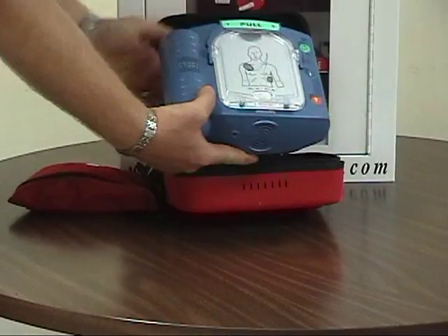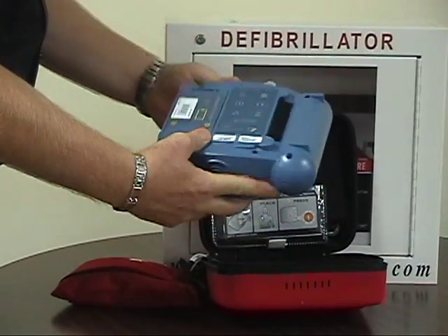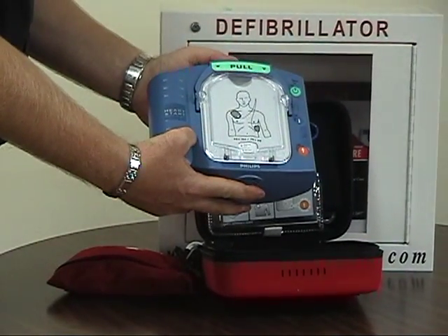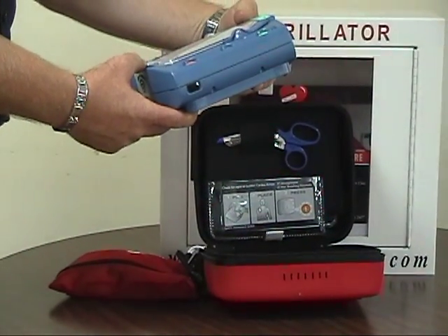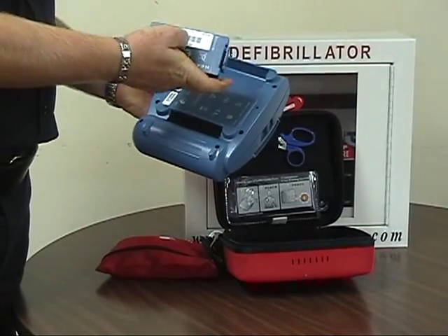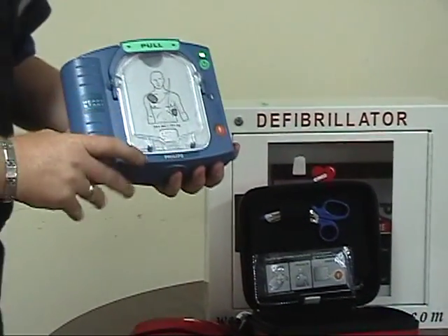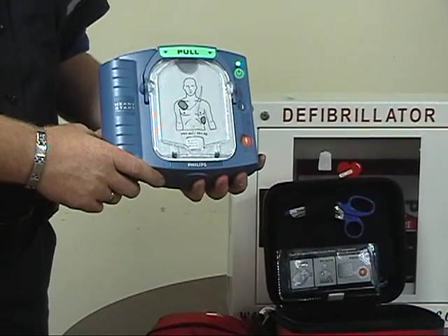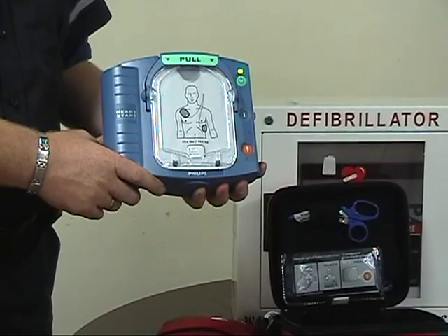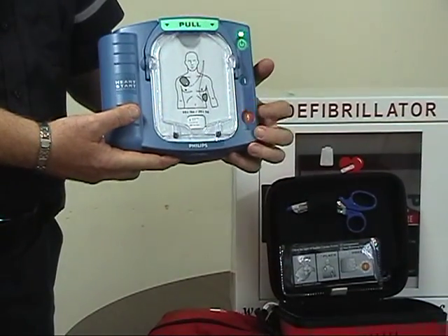Perform a hands-on inspection of the public access defibrillator to ensure there's no damage to the exterior. Check the electrodes and the battery for expiry dates. Only change the electrodes or battery if they are expired. Remove the battery and reinstall it to perform a self-test. Replace the battery and follow the prompts of the public access defibrillator.